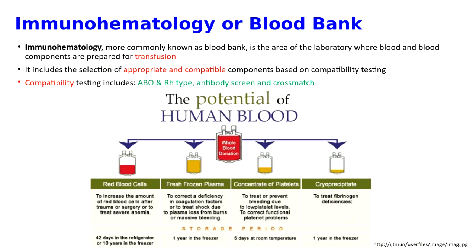So blood products that are donated will be the ones that are processed and tested so that they can be used for human transfusion. Blood bank testing is very comprehensive, but we're only going to touch here on the very, very basic. We're only going to talk about the basic blood typing for ABO. ABO typing, meaning the antigens present from the ABO family that determine the blood type.